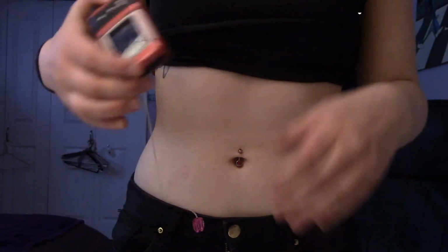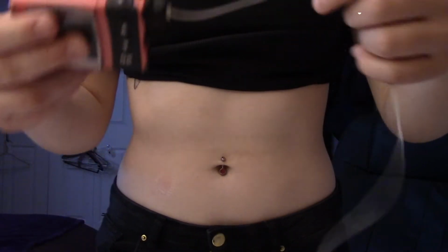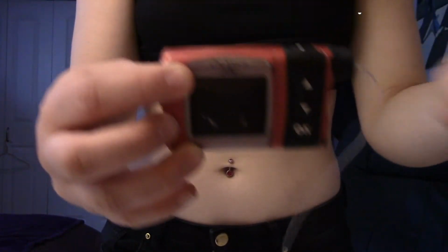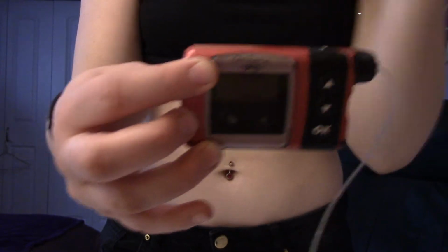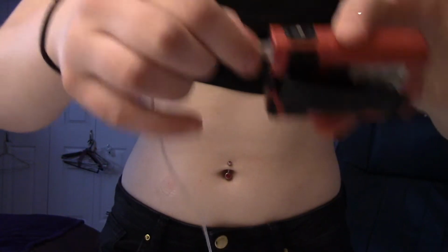Alright, next thing I'm gonna do is I'm gonna take out my old insertion stuff. So you'll see that it's still attached like such. I want to make sure that this is out, and then the cartridge that has the insulin inside is taken out as well. So pretty easy. All you gotta do is just twist and pull.